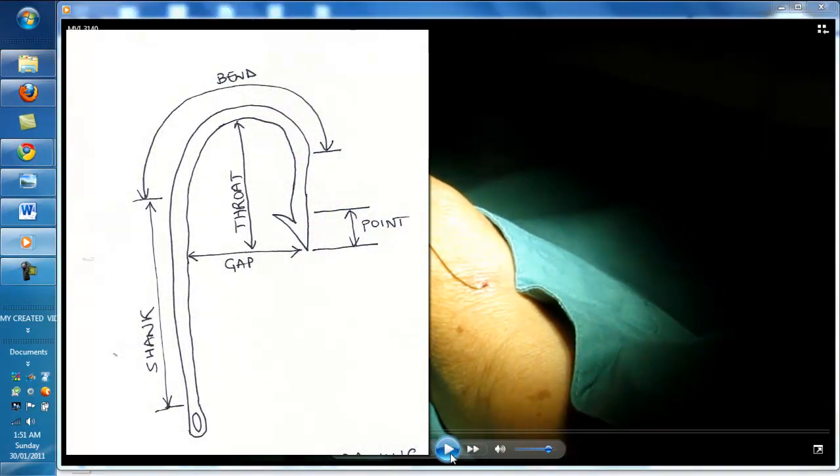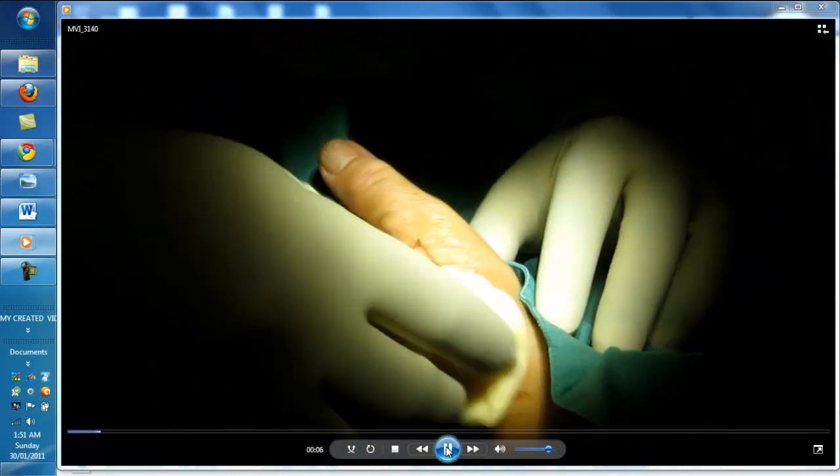Okay, the first step is obviously cleaning up. This is a fishhook embedded into the skin — it's the one with a single barb only. So just clean it up and give it a clean.